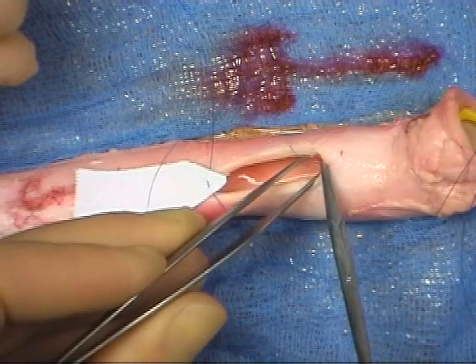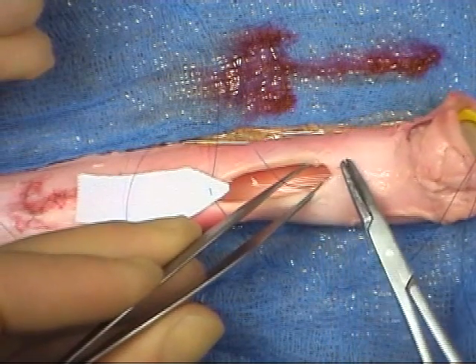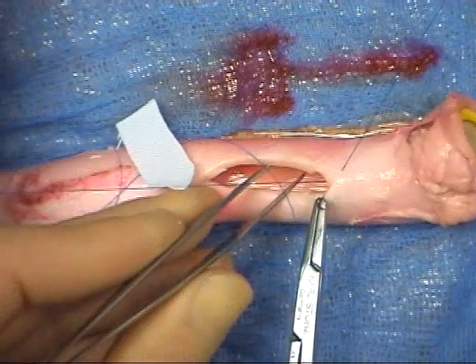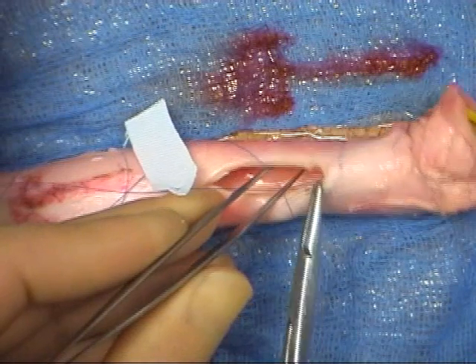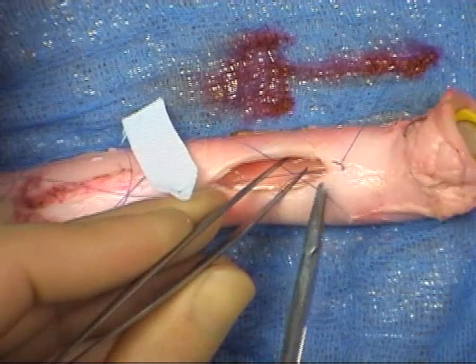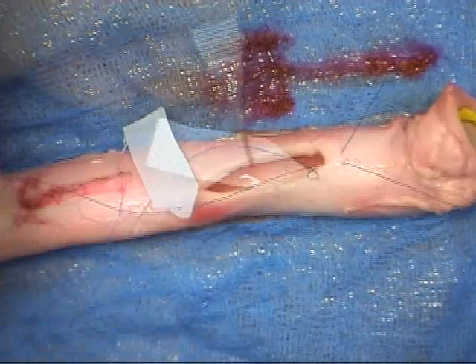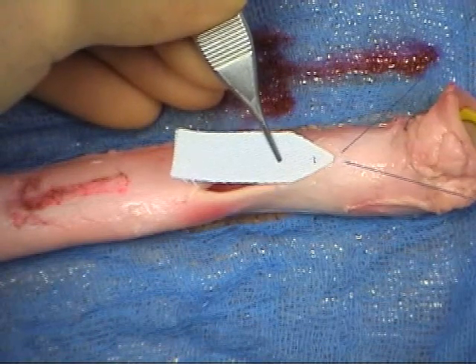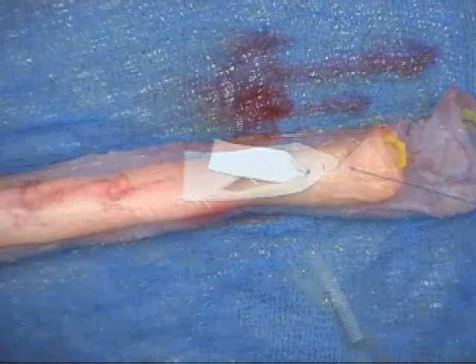The second needle is then passed through the vessel wall, from inside to out, at a point just lateral to the first bite. As the sutures are tightened, the graft can be placed at the apex of the opening, where it will start bedding in to the wound. The long ends of the suture are tied with a two-handed knot, at a distance from the tissues, and then slid down onto the vessel.